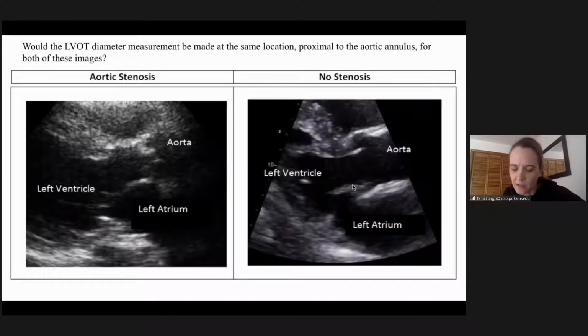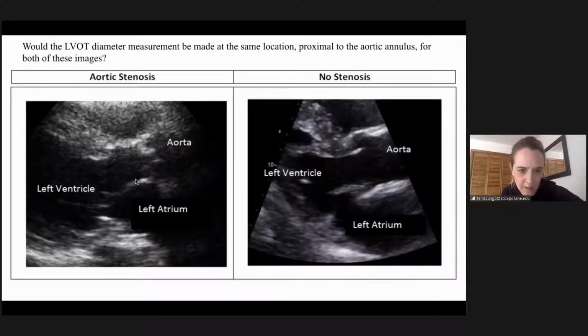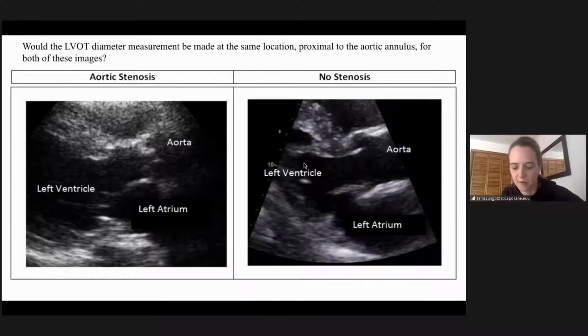This is one that you have to make sure that you open. I will freeze it and I'll play it back and forth and back and forth. It's really hard to tell on a still picture, and then you can see where the leaflet's open. Where would you measure on the other picture? Yeah, you're probably going to be back up over in here down to here in this area, because there's probably some pre-acceleration right in here that you don't want to measure. I'm assuming you're going to be Dopplering back here, so it can actually be back to here and here. So further into the LV, you want to measure. Yeah, and again, you'd have to look at that apical 5 chamber and see where you took that pulse wave from.